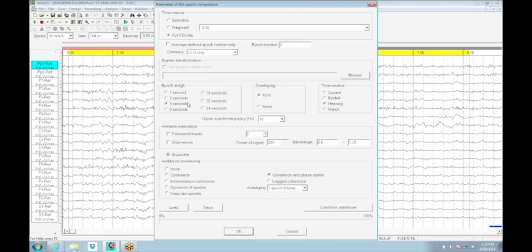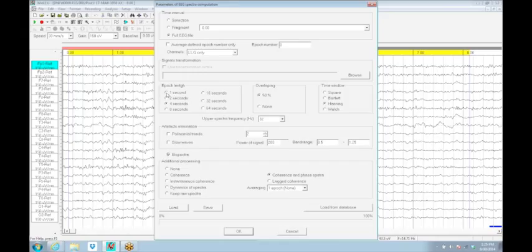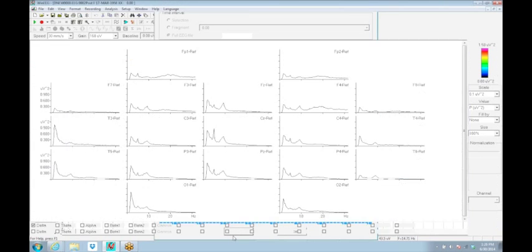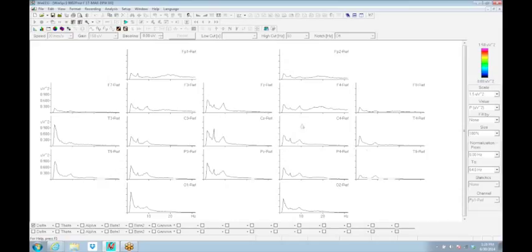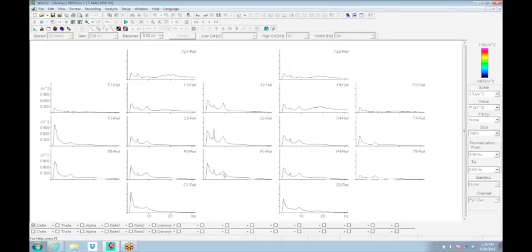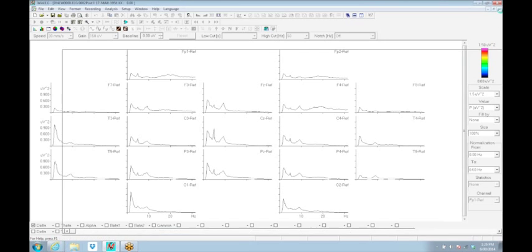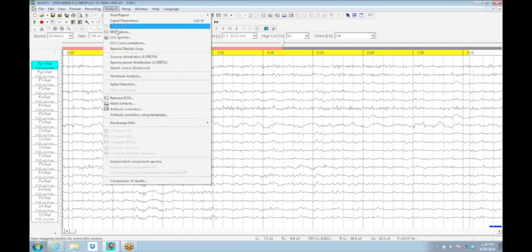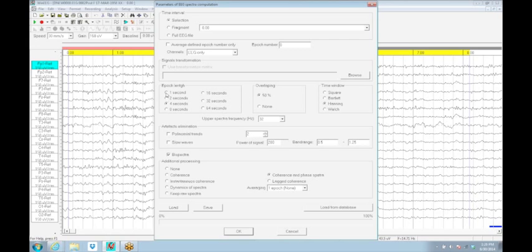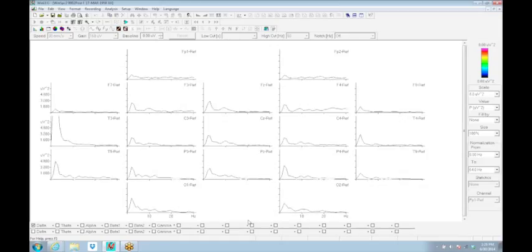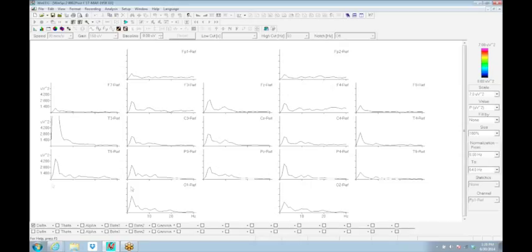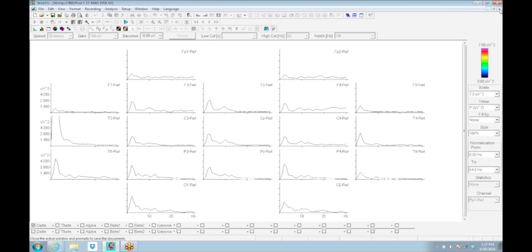I have it set for a four-second long epoch, which gives us quarter hertz resolution at the end, a very fine FFT. Some of the older databases only give you one second long epochs, which give you a more blunted view of the Fourier. Here you can see the narrow peak. You can see the detail of some of these little tiny pieces, the multiple steps within the alpha peak here in the parietal area. If I turn down the sensitivity by going back to this one-second epoch length, the typical resolution, I don't have that resolution anymore. Where's that nice, narrow, little spectral peak that was in there? You lose quite a bit of resolution by dropping to one hertz.